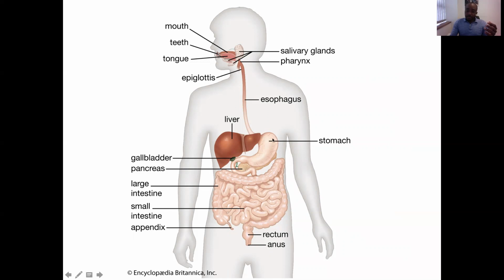You can see the fundus of the stomach there, and the wall of the stomach tends to have increased rugae. And then this ends as the pyloric antrum, and then the pylorus, which then continues here as the first part of the duodenum, second part of the duodenum, third part of the duodenum, and then you start the jejunum from about there. So you have mostly the jejunum, then the ileum.